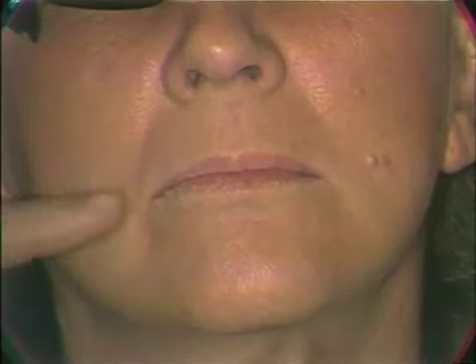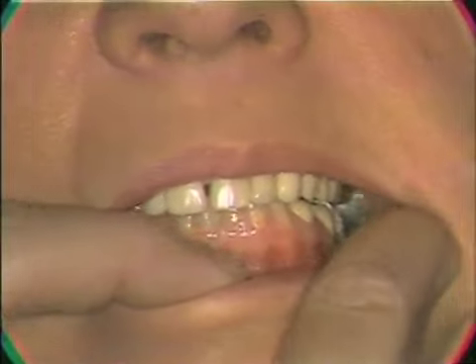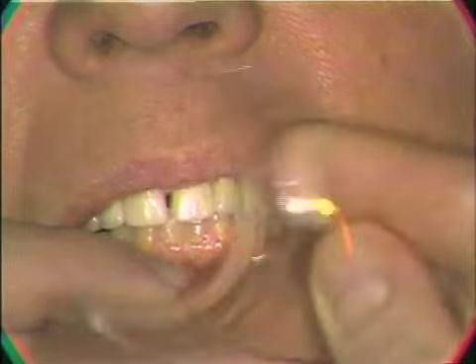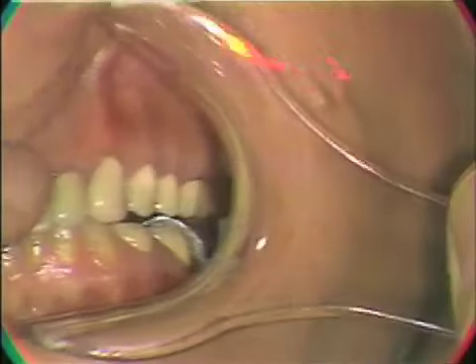Now, with your teeth together, let me go in there and make sure that the occlusion is right. Make sure that the posterior teeth, open, please. Make sure that it's closed again now. Turn your head this way just a little bit.